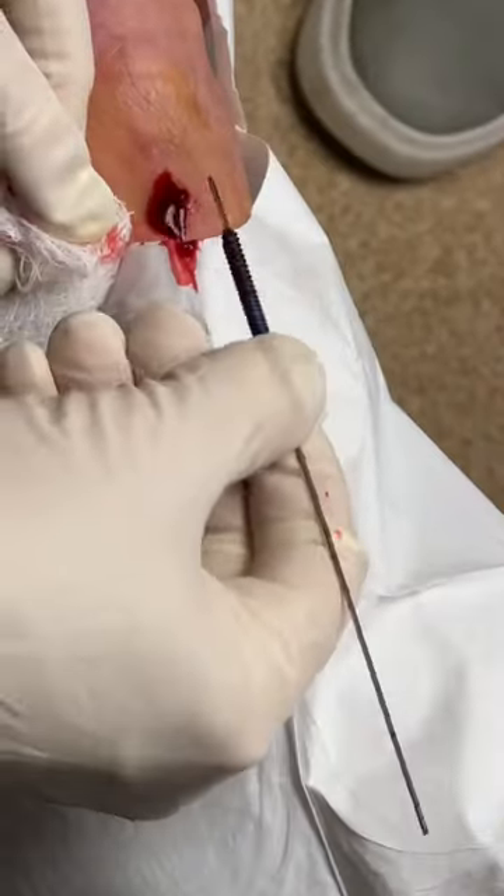Did you ever wonder how we get a screw out of a patient after surgery? Check out this video — we're removing a screw from this patient's foot after bunion surgery because the screw was slightly prominent.